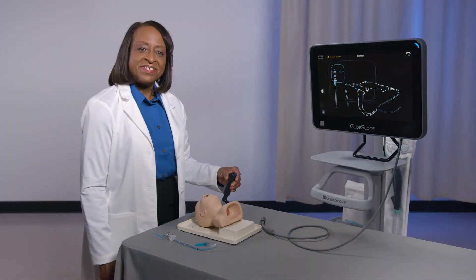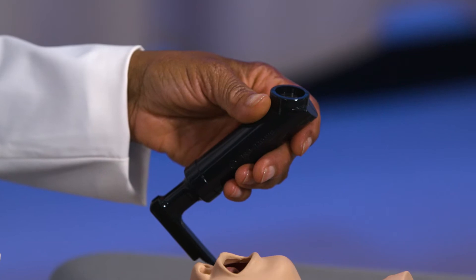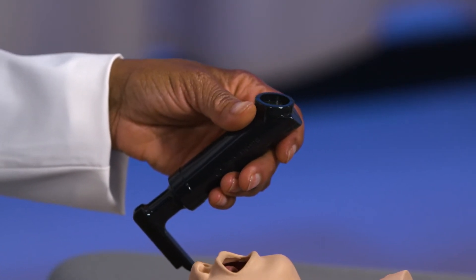This includes surgeons, nurses, and our students. Today I'll be using a GlideScope Core video monitor with a Spectrum Miller video laryngoscope on a pediatric mannequin.